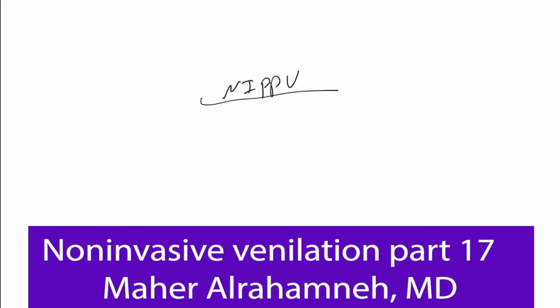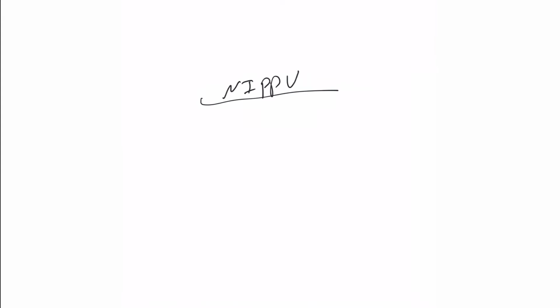Welcome back to a new episode of non-invasive ventilation, and today we're going to talk about caring for these patients as a physician or as a resident. So remember, those we put on non-invasive ventilation urgently or emergently for an acute event, hypoxic or hypercapnic, whatever, they need to be monitored at least in ICU or IMC.